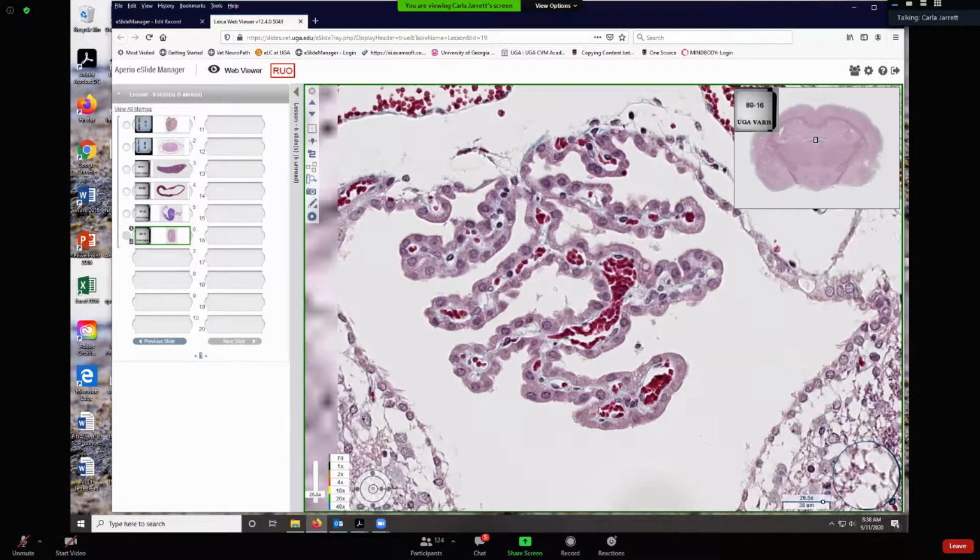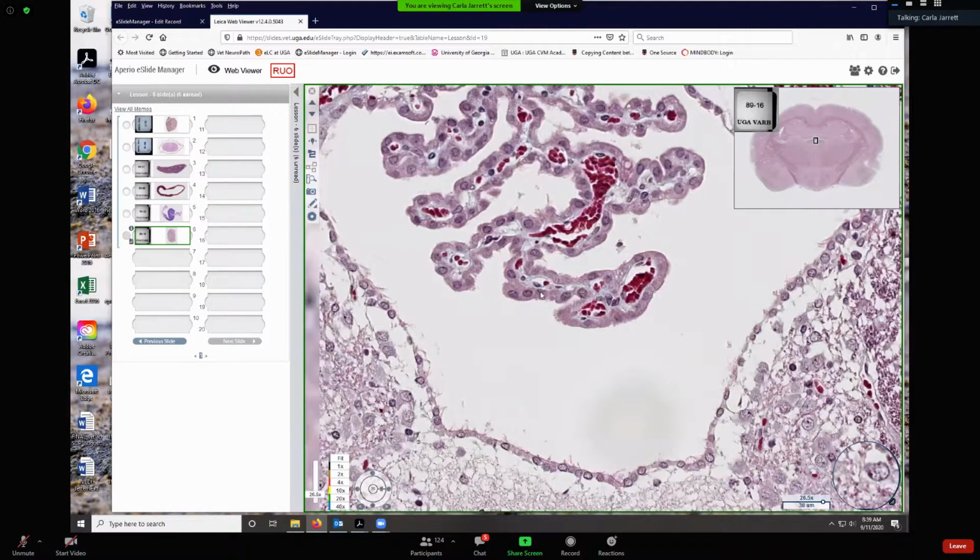Choroid plexus, and you'll see them grossly in neuroanatomy, but microscopically in histology, you'll also see them. So you'll want to recognize this. ID this as a choroid plexus. ID this modified ependymal cell layer here on the surface, ID the underlying connective tissue and blood vessels, which together is called the pia mater, and know what it does. Know that it secretes cerebral spinal fluid.